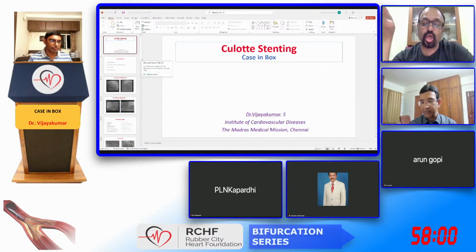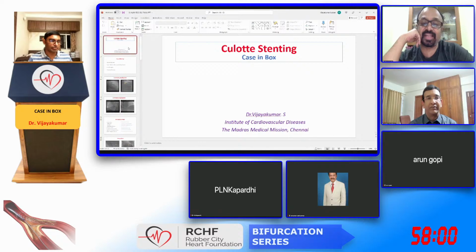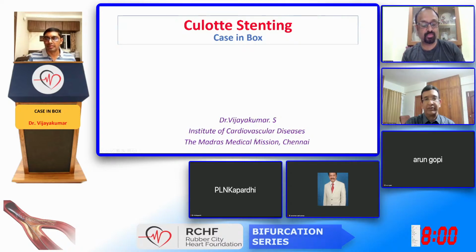Just stop with the provisional single stent strategy on the first day. Yesterday we had the most important discussion on DK crush. And today we have a competing 2-stent strategy, that is the Culotte technique. The last 2 days have been very enlightening, and I'm sure today will be equally good. Without taking much time, we will invite Dr. Vijay Kumar to give his talk. He's going to share his experience in the form of a case in the box. Over to Dr. Vijay Kumar.